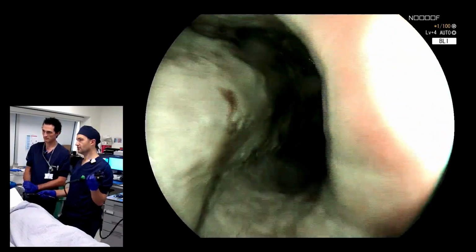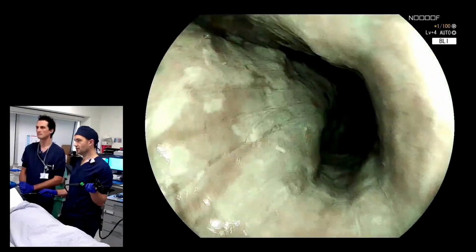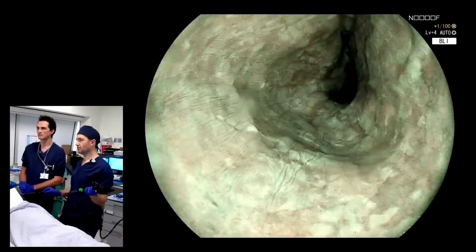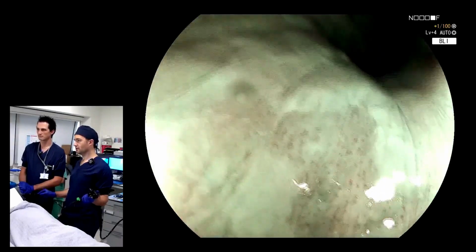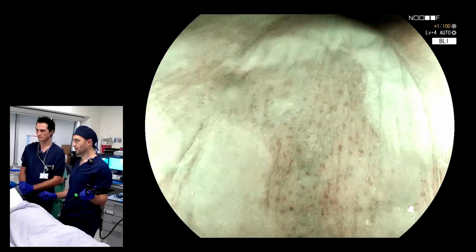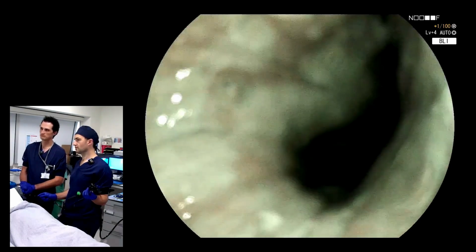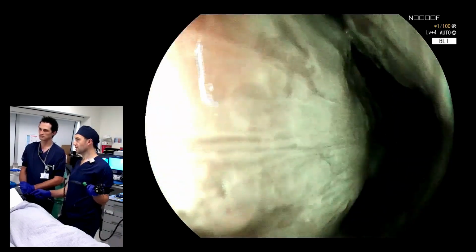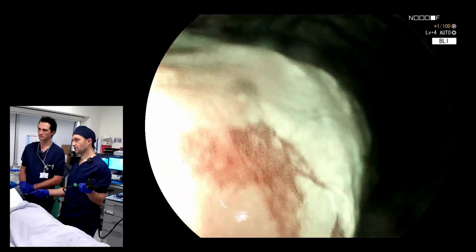or i-scan, in this case BLI because we are using Fujifilm, then what do you see? You probably see an inflammatory IPCL pattern. And if we can find this, that would be nice. I think you clearly see it here. You have IPCLs which are regular but hyperchromatic, so they are more brown than the standard IPCLs. And you can go searching for those. Of course, these patients are at risk of cancer, and here's actually some different type of mucosa.